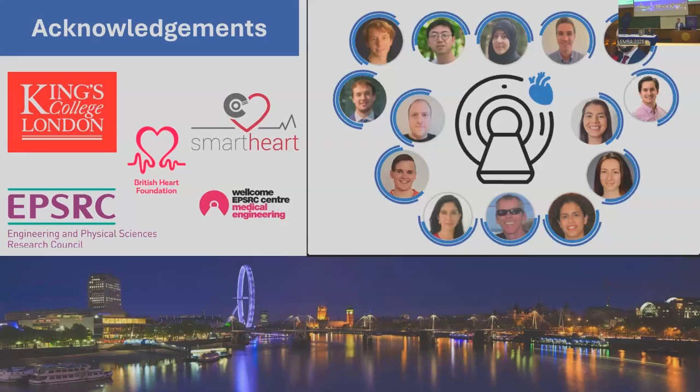Good being, we could see it quite clearly, but maybe there was a little artifact there. And then 3 being adequate, 2 noisy, not very clearly seen at all, and then 1 obviously uninterpretable. So it was for the CMRA rather than as a direct comparison.